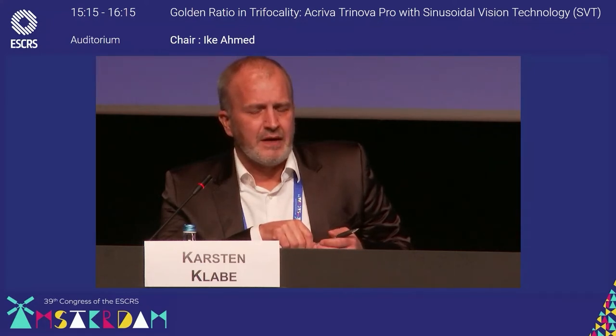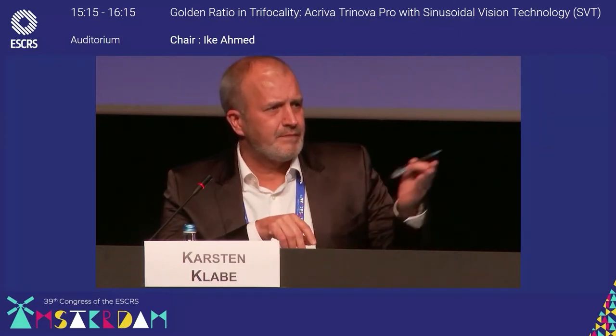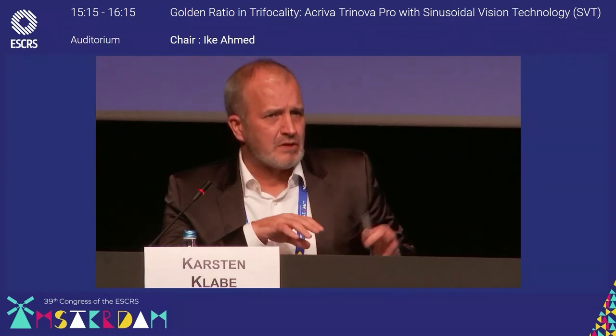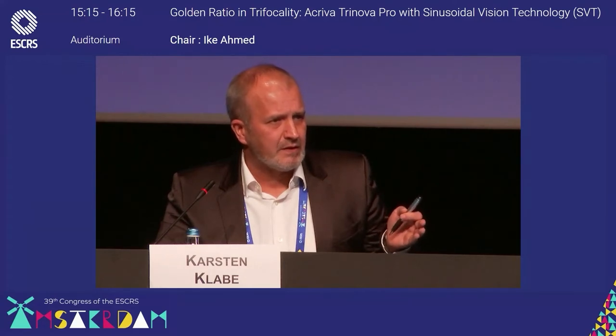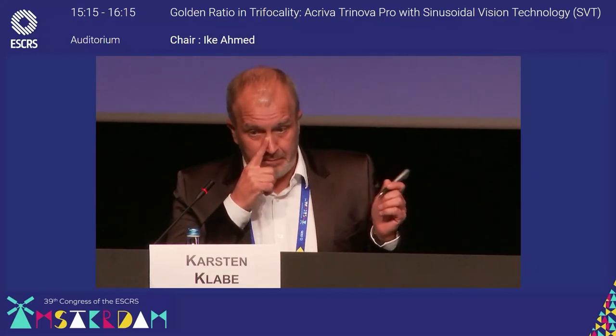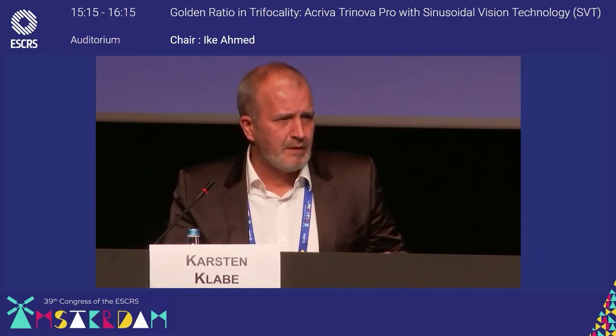For implantation, if you have a larger capsular bag, I see a higher risk. With other platforms and other types of lenses, I use plate haptics in any range. But mostly you are right, mostly monofocal lenses, where decentration doesn't play such an important role. And in really highly myopic eyes, less than 10 diopters lens size, there is, in my opinion, a theoretical higher risk of slight decentration with a plate haptic. So the design is good. We all know C-loop haptics as well, and I trust them.